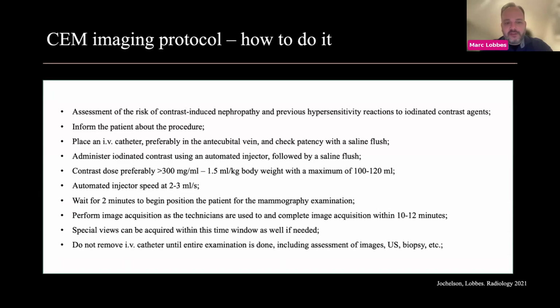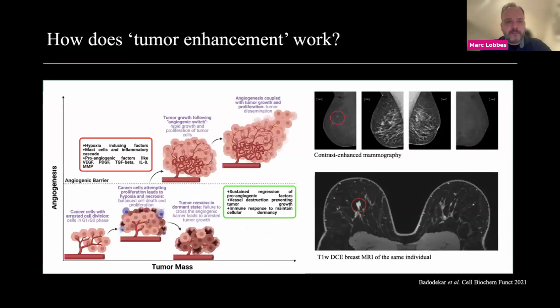And we always recommend: do not remove the IV catheter until the entire examination is done. You can have slightly delayed hypersensitivity reactions, and you can always do the ultrasound, the biopsy, talk to the patient. And before you conclude all of your diagnostics, it's easily 15 or 20 minutes down the road, and then it's a safe period to remove the IV catheter.